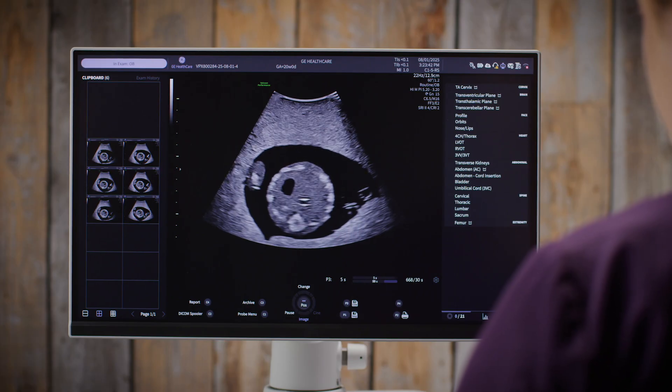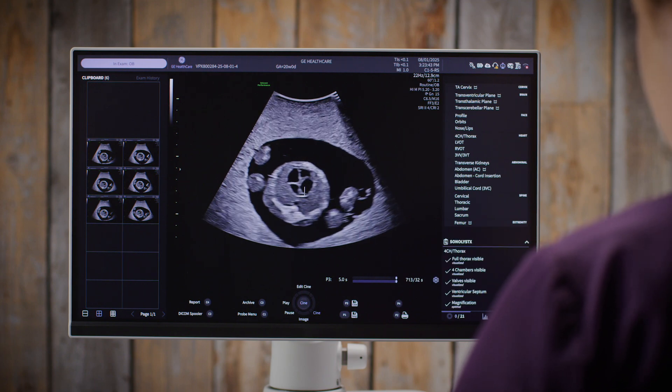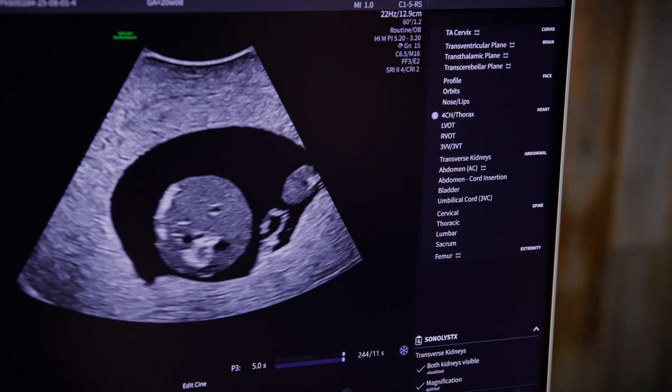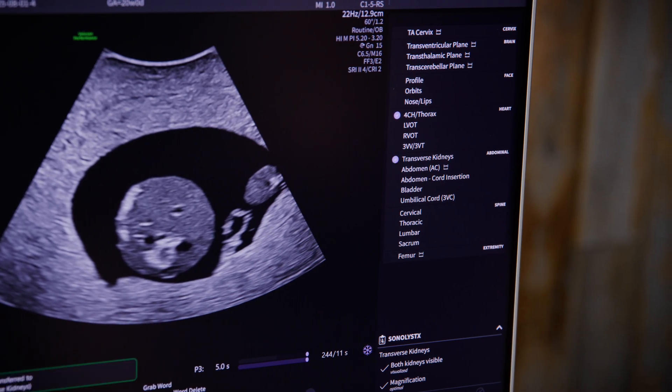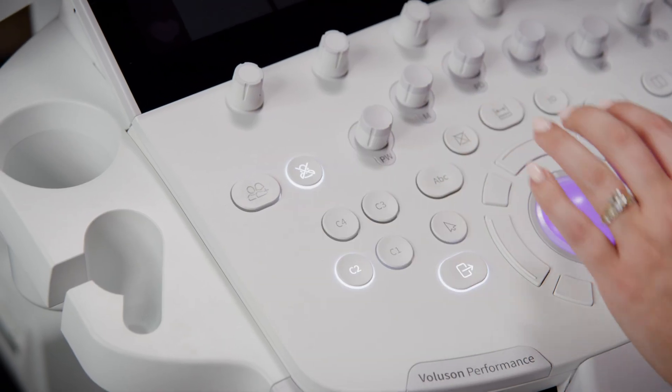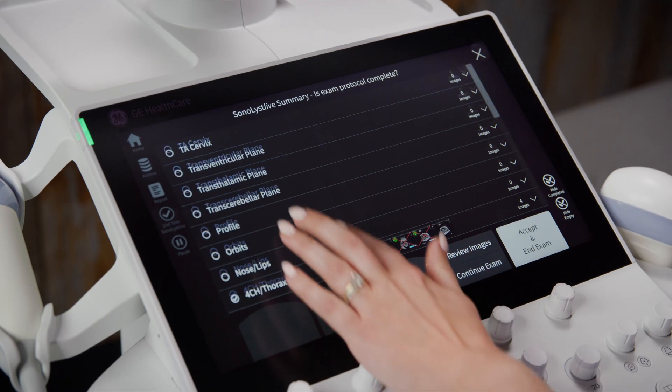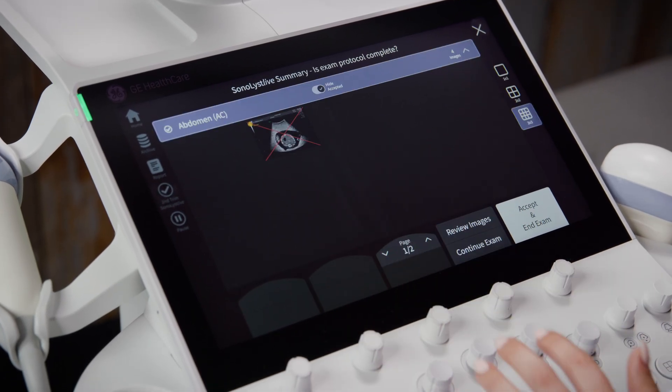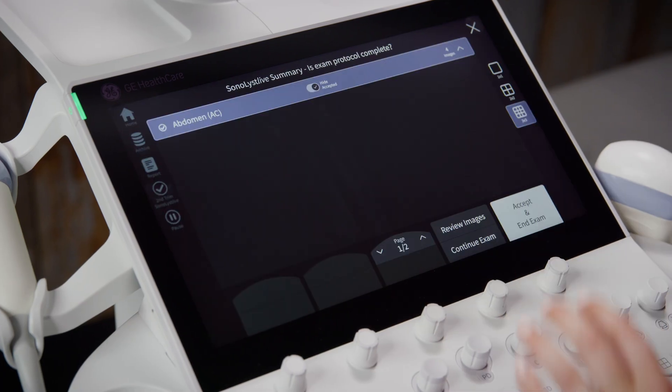Let's start with background assistance. Think of this as your silent scan partner, which doesn't change your workflow at all. As I scan and take images, the AI is quietly working in the background, recognizing views, checking them off the checklist, and capturing images silently into what we call the Quiet Capture Library. Think of it like scan insurance. If I miss a view during the exam, I can check the Quiet Capture Library at the end. Just press End Exam, and you'll see any silently captured images marked with an X on your checklist summary. If I want to keep one, I just tap it and press Accept. Anything I don't accept gets deleted when I finish the exam.